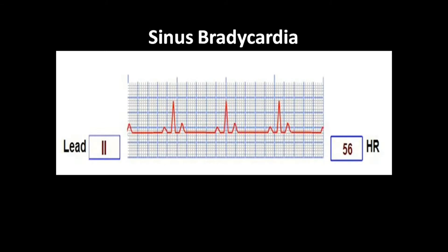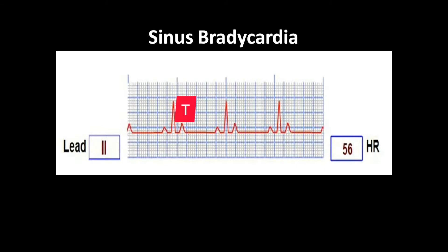Here again you can see a P wave, QRS complex and a T wave. And there will be an isoelectric line, then again a P wave, QRS complex and a T wave. So this pattern is repeating.